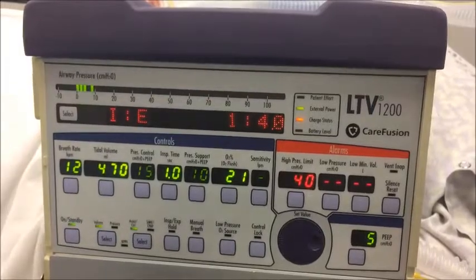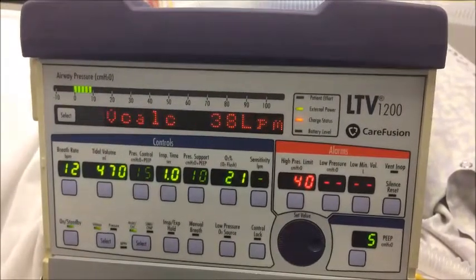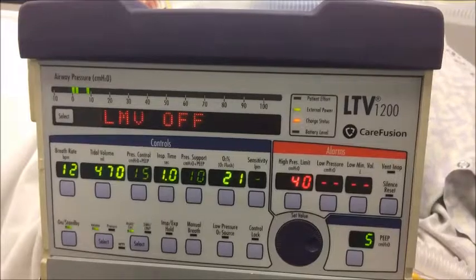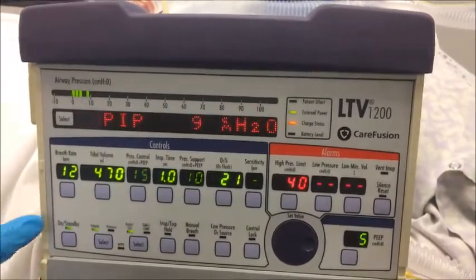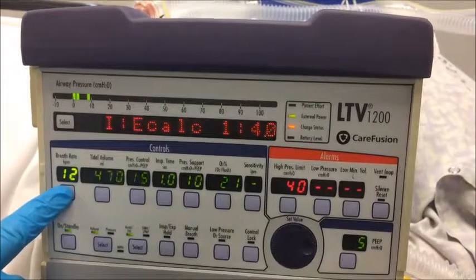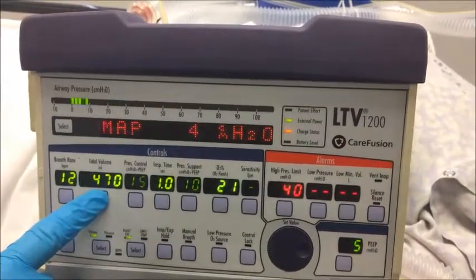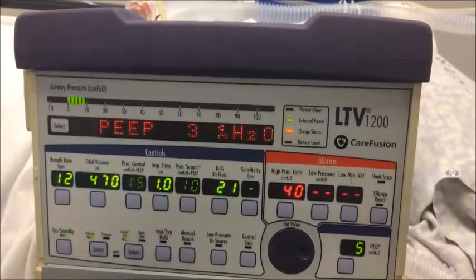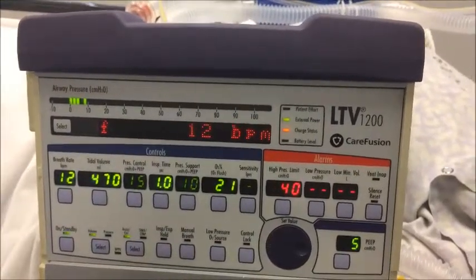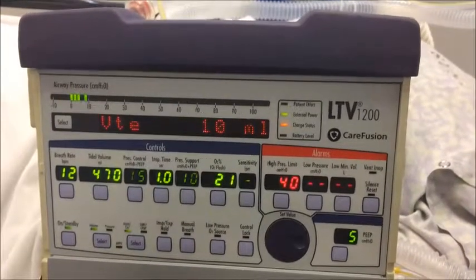If you need to make an adjustment to the patient in regards to their ventilation or end tidal CO2, your adjustments will be made by adjusting the patient's rate or by adjusting the patient's tidal volume. These adjustments will help support whatever your patient needs based on your presentation during transport.